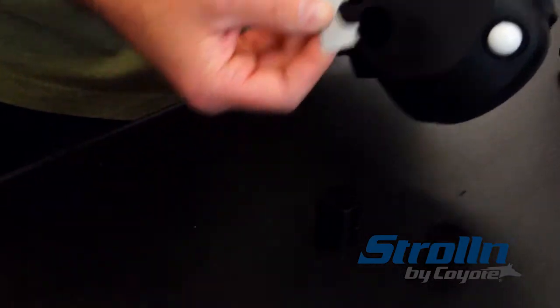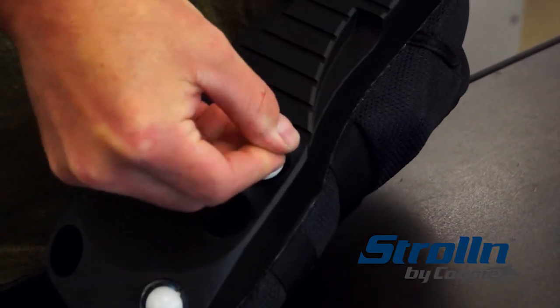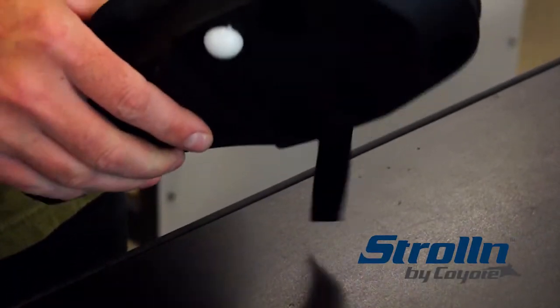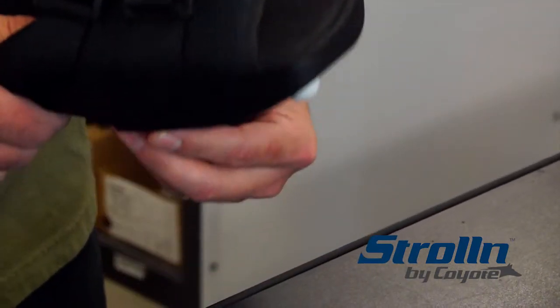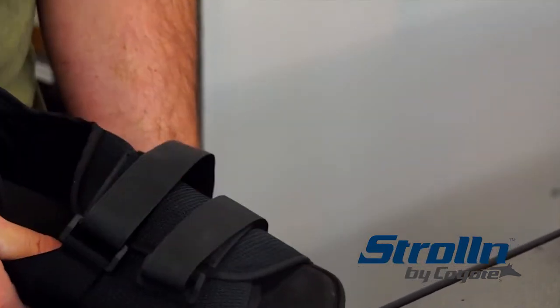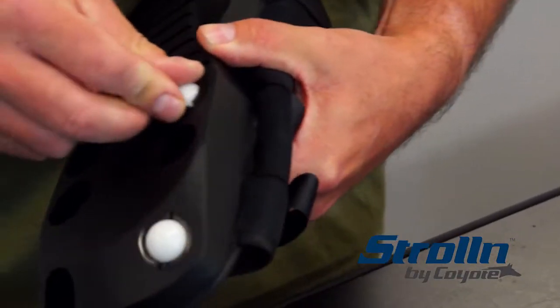Okay, so I'm going to show you how to remove the bushings with the tool that you get in your kit. All you're going to basically do is take your tool, drop it in the little grooves of the bushing, and then you'll turn them counterclockwise about a quarter of a turn. And then all you have to do is bang it on your hand or a surface till it starts to come out. Sometimes they just fall right out. Sometimes you have to grab it.